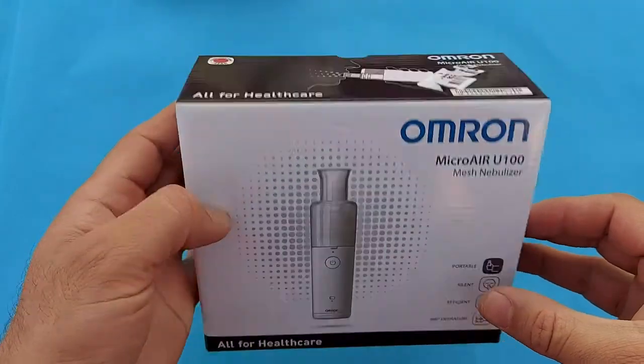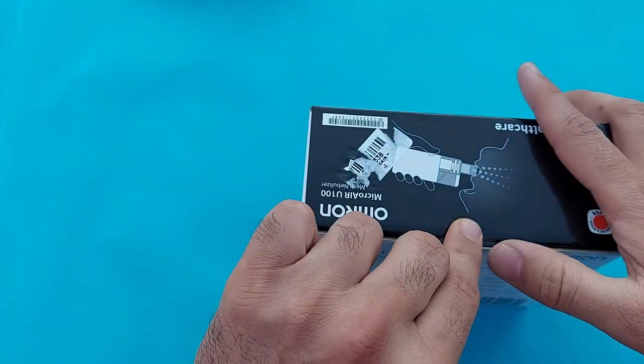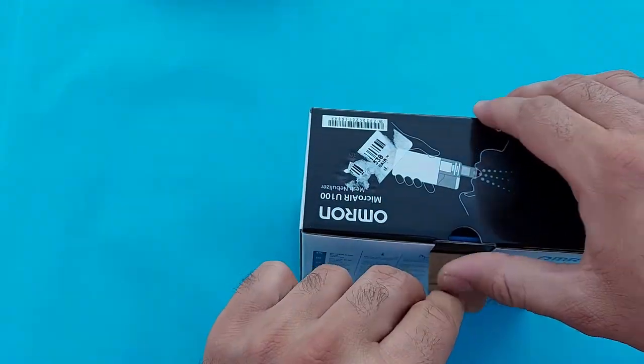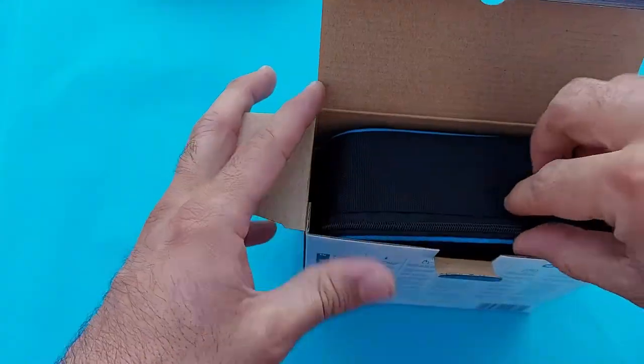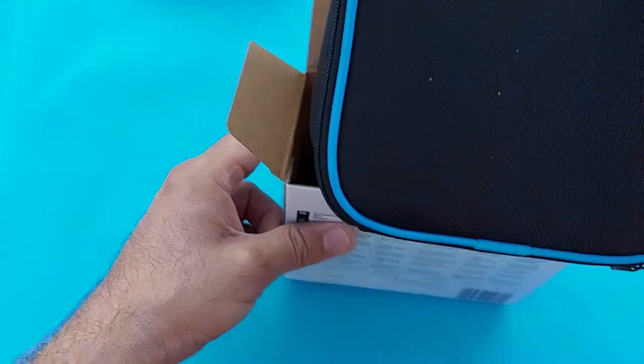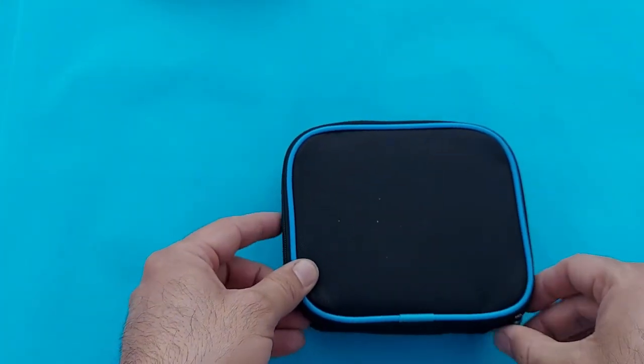As you can see, this is the Omron Micro Air, a mesh nebulizer enabled with mesh technology. It is a battery-operated nebulizer — it does not need electricity. You can install the batteries and use it at home anytime.